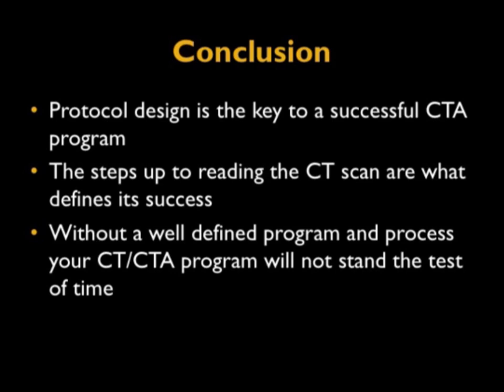So concluding then, protocol design is just so critical. Both lectures made that point. But it's not just the protocol. I have to admit that I should put in the protocol how to read the study. So it's not enough to do the study correctly. You need to be able to read it correctly. That's so dependent on the protocol design.